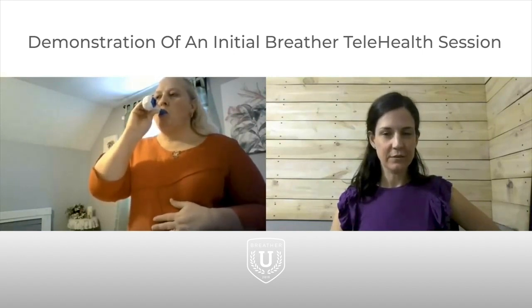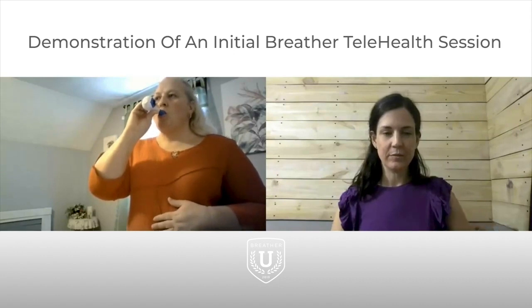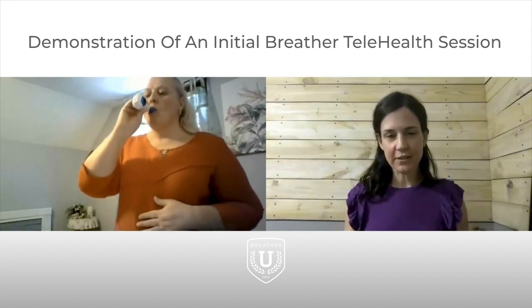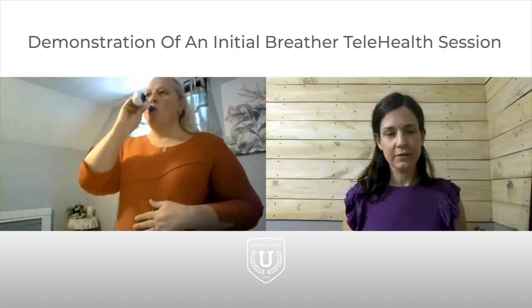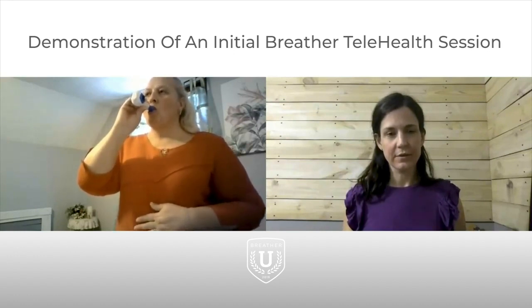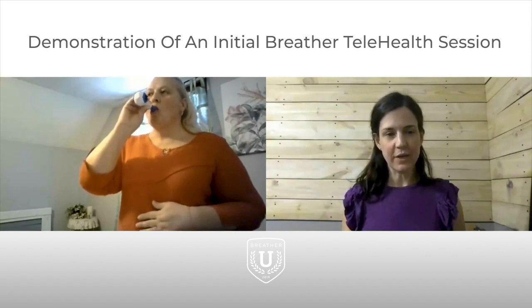And out. Go 6. Use that diaphragm. You're starting to use your chest. Good. Good. Last one.